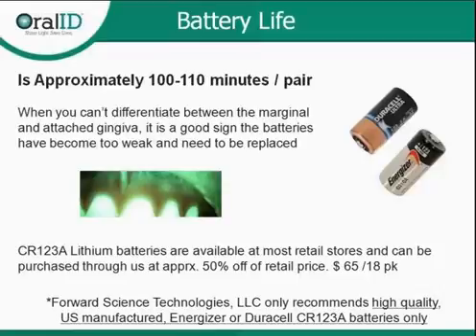What size battery does it take? What size battery? It's CR123A lithium. So it's a special battery. It's a lithium battery, yeah. I wouldn't say special. It's a common lithium battery. You can get them at Walgreens or CVS or Radio Shack.